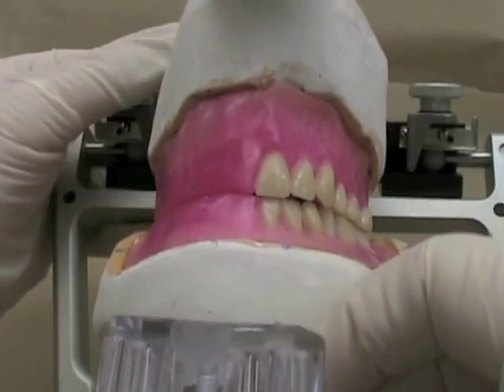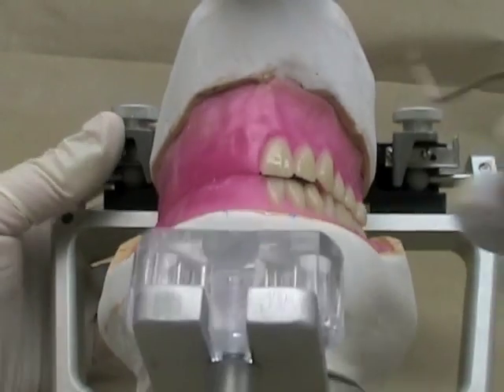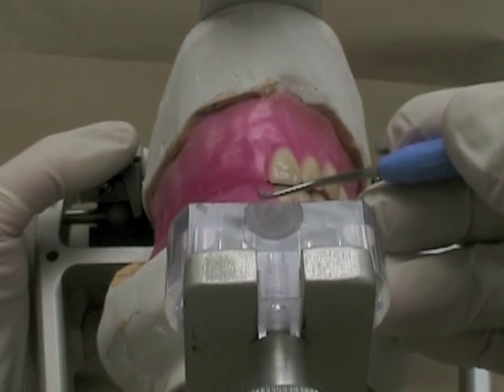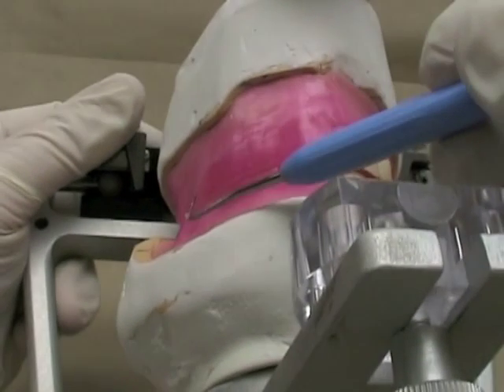Before we begin setting teeth, you should make sure that your rims are adjusted properly. There should be about one and a half to two millimeters of overjet between the mandibular rim and the maxillary rim. You can take a look in the posterior region here.